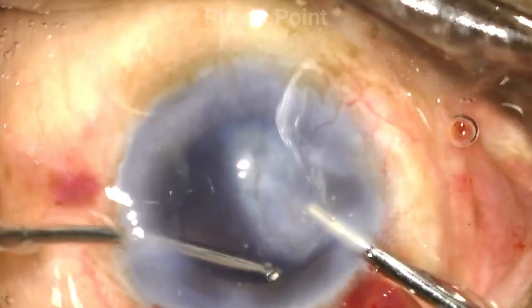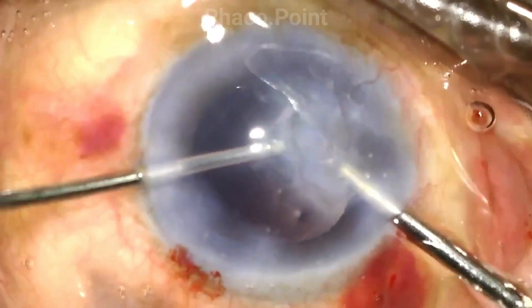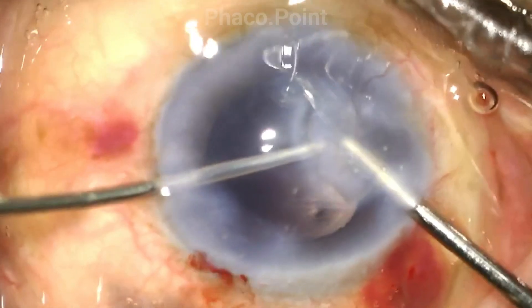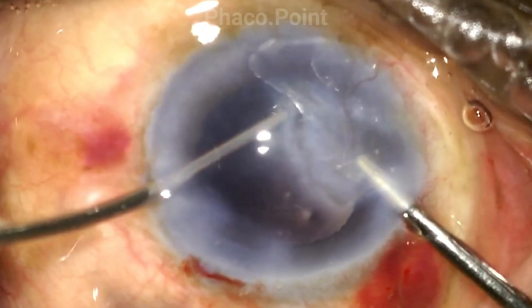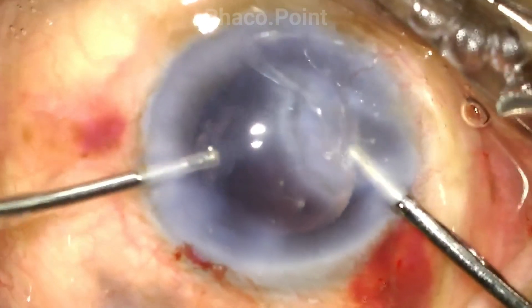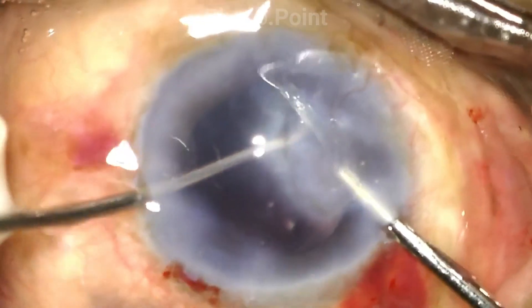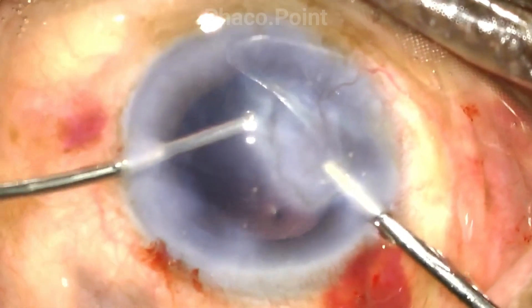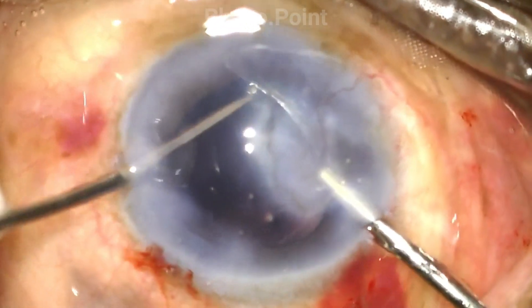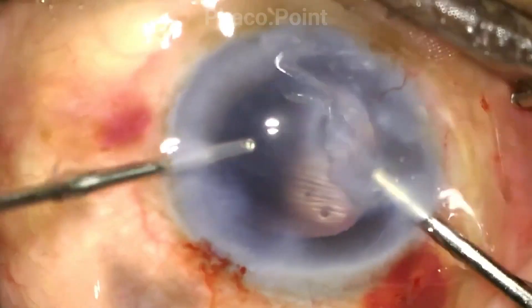In this case however, you will note how I am able to go deep to the cortex, hold on to it, pull into the center, and complete the aspiration of the cortex in the clear zone under direct visualization.